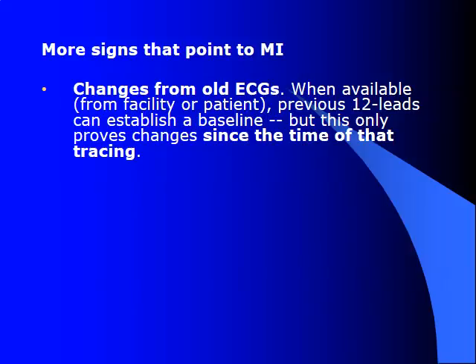Also, as we mentioned, changes from old ECGs, when available from the facility or patient, are a great baseline, but this only proves a change since the time of that tracing. So if it's 10 years old and they've had 4 heart attacks since then, it doesn't really do us a whole lot of good.